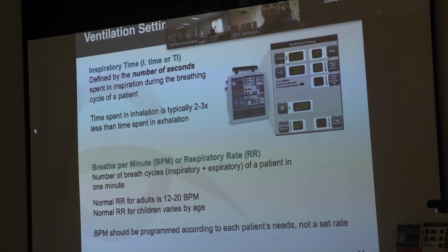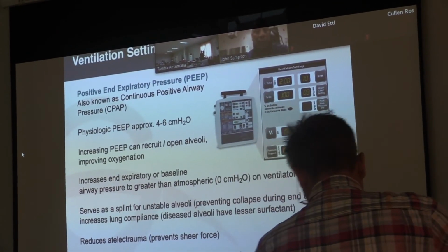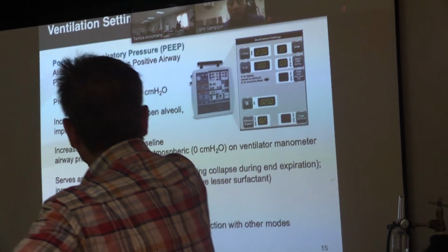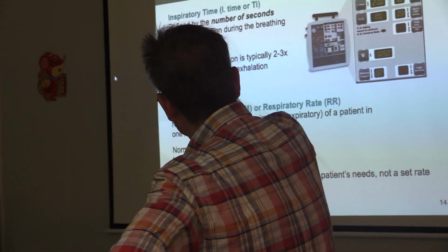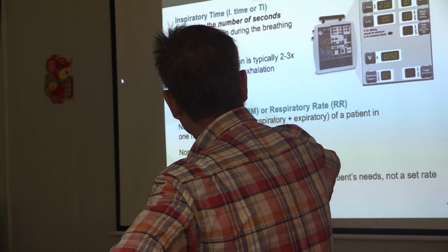We can do both, Joel. Okay, so the inspiratory time, turn the ventilator towards me.